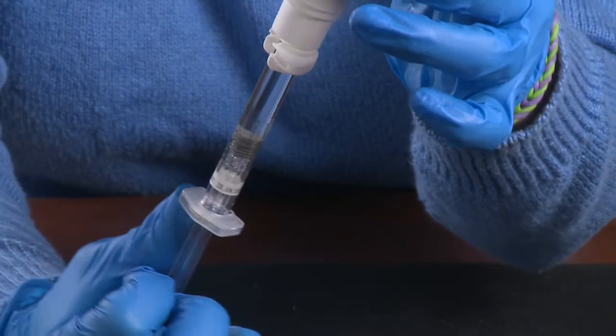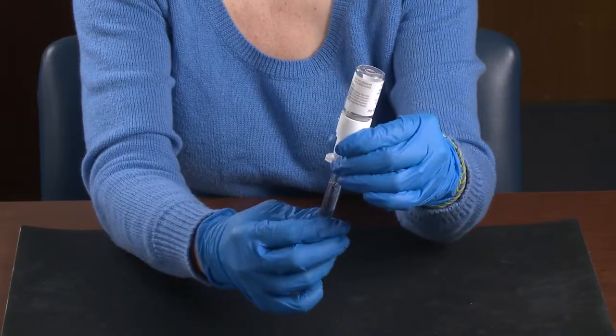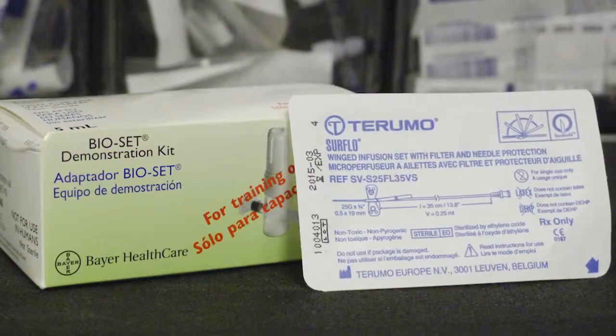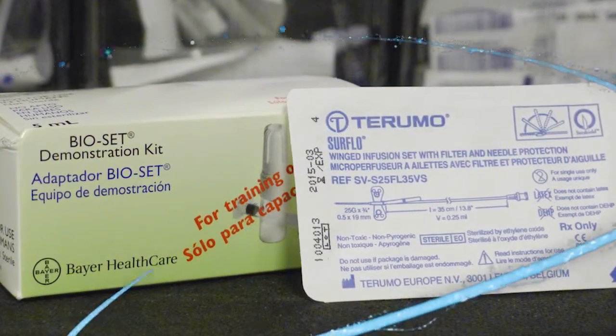Tilt the vial from side to side and back to get all of the factor out. Next, unscrew the syringe. You're almost ready to infuse. Bayer recommends that you use the infusion set that comes with the BioSet as it has a built-in filter. Now, you're ready to infuse.